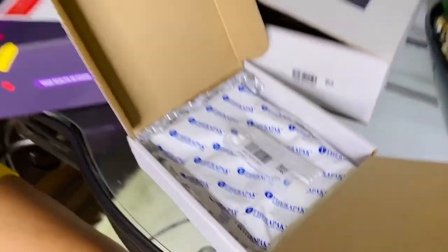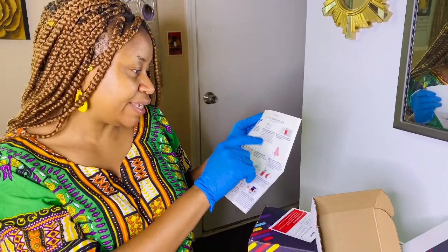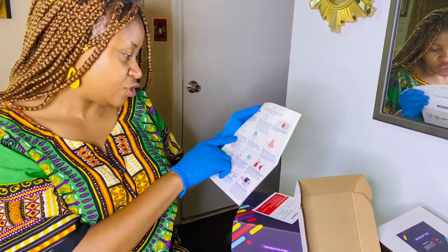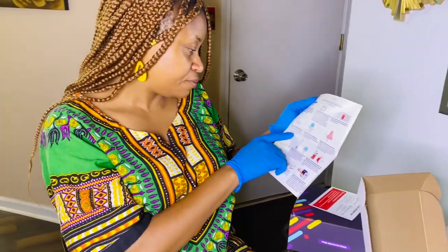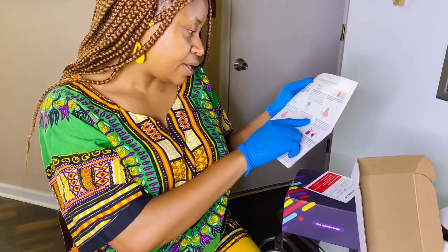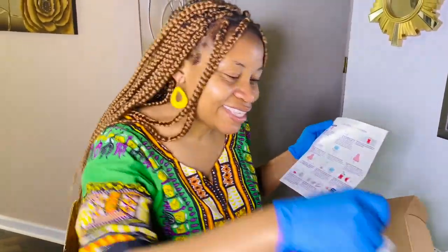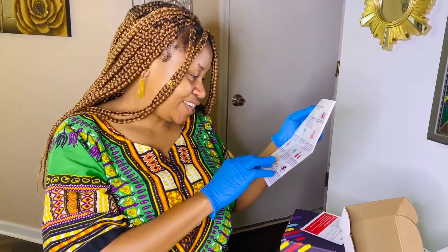Visit this drop-off location. Wash and dry your hands before opening the kit. Open your kit and place all the contents on a clean, dry surface. Take one of the cotton swabs out of its package. Do not touch the cotton tip of the swab with your hands. Okay. Screw off that sample cap. Hold the swab in your hand, and hold the collection tube carefully, not to spill. Do not drink the liquid. Do not drink this liquid, guys. The liquid in here, do not drink it. That's one of the instructions. Okay, do not drink the liquid.